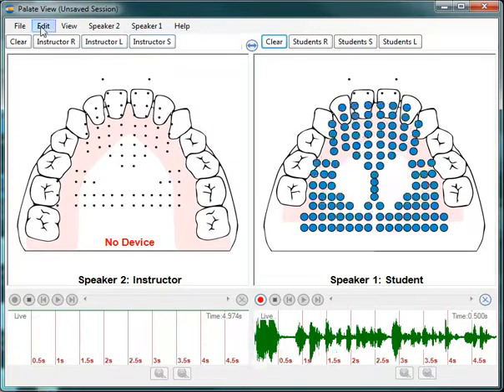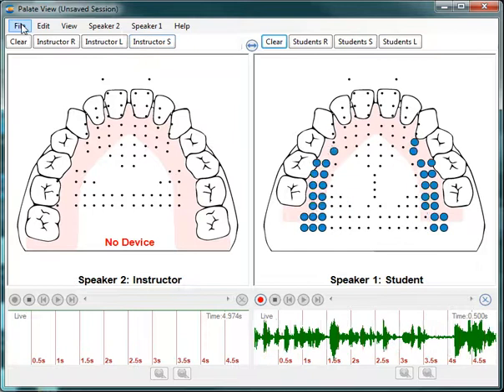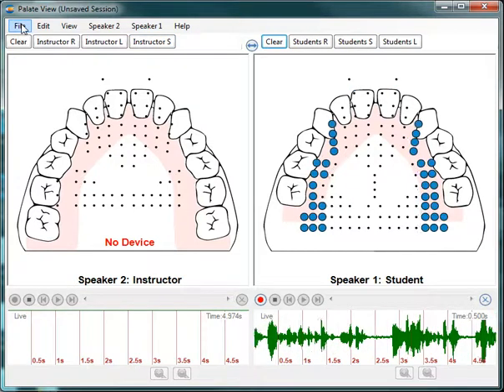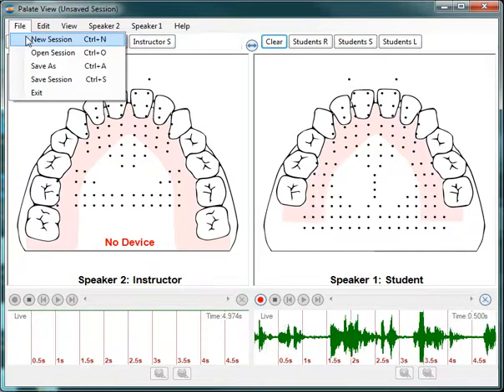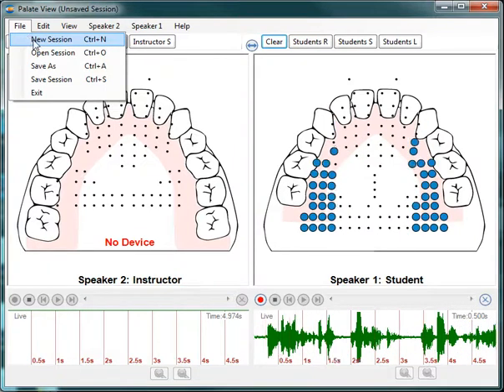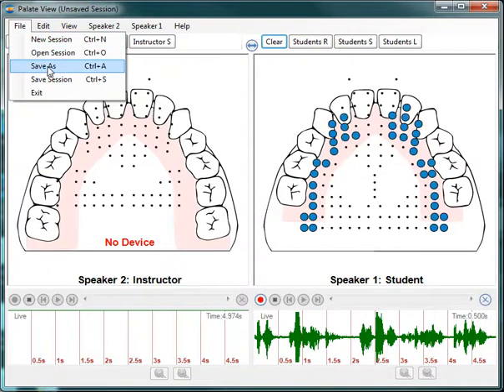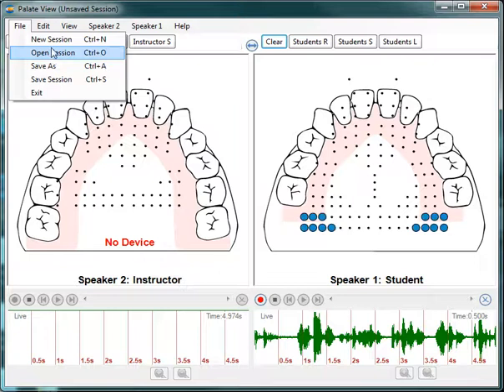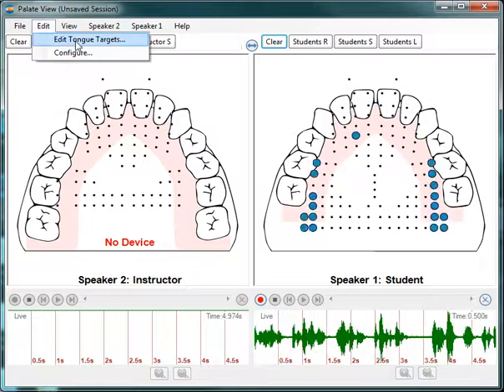Here in the general navigation at the top left you have some basic features. Using the file tab you can create a new session, open old sessions, save sessions, or exit the program. Using the edit tab you can edit tongue targets.